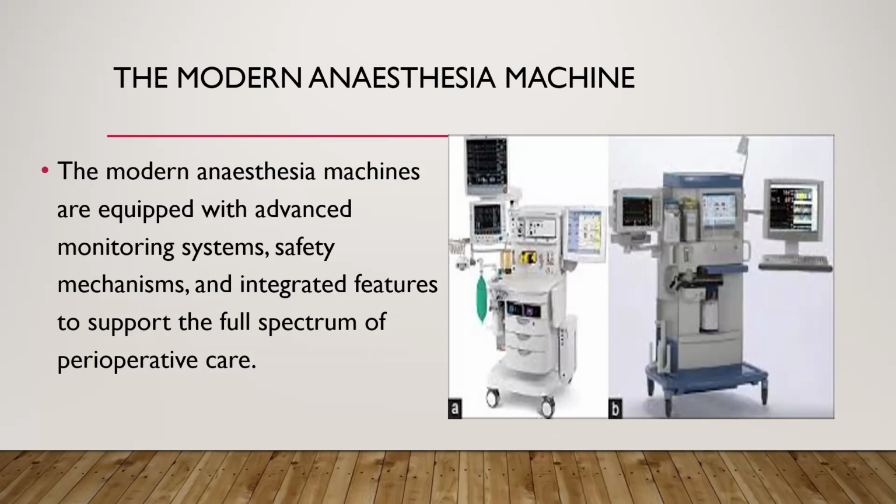The machine they came to present to us can actually monitor depth of anesthesia, and they have incorporated computer software. When the depth of anesthesia is too much, the ventilator just reduces the anesthetic agent that it delivers to the patient.